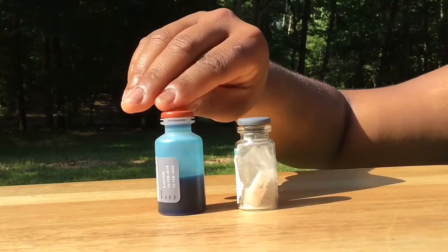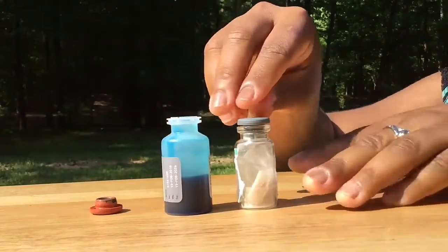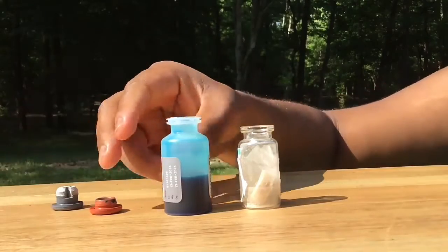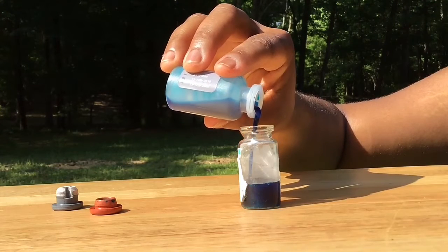To mix your vaccine, carefully take the lid off the diluent bottle as well as the vaccine bottle. Next, pour the diluent into the vaccine bottle. Here you will see the vaccine dissolve into the diluent.